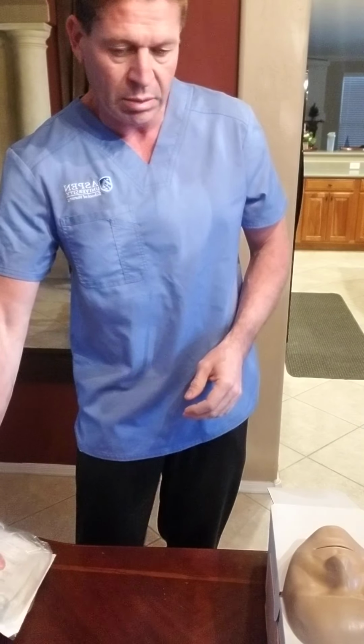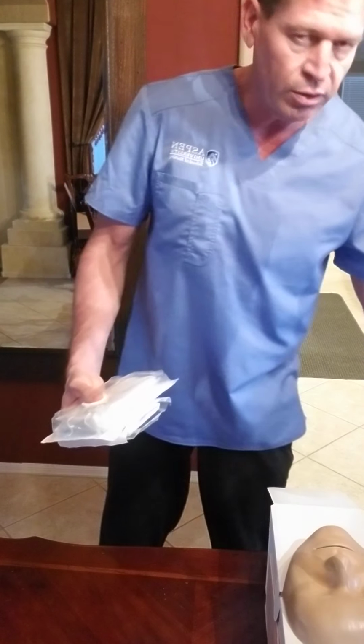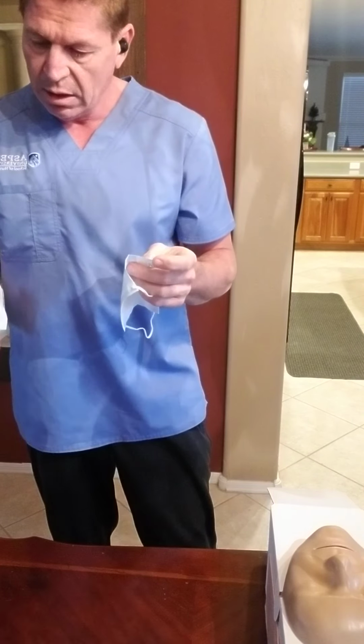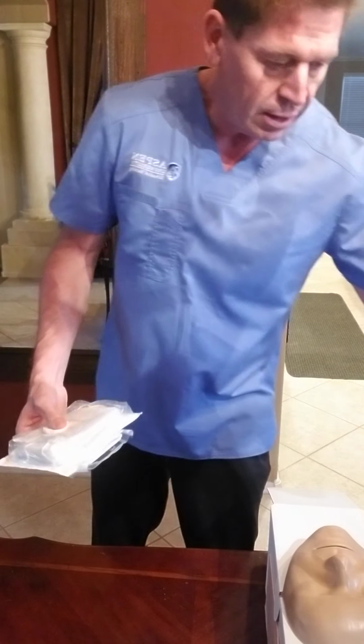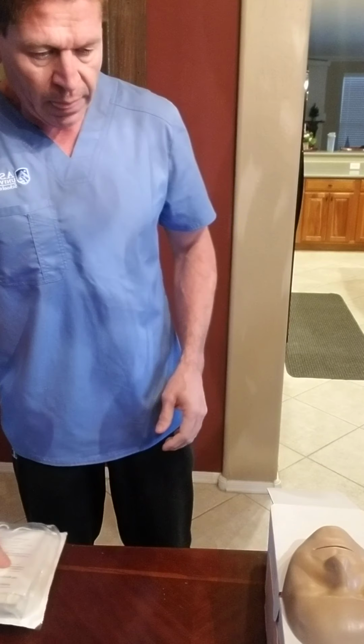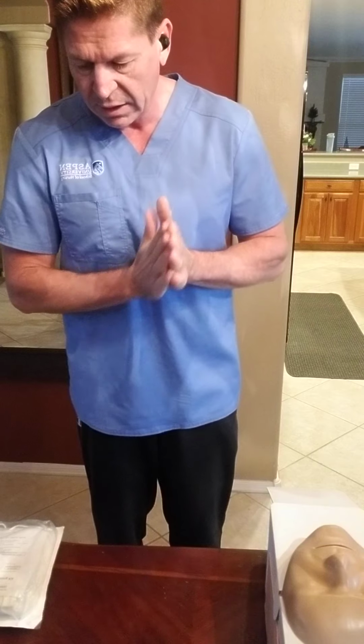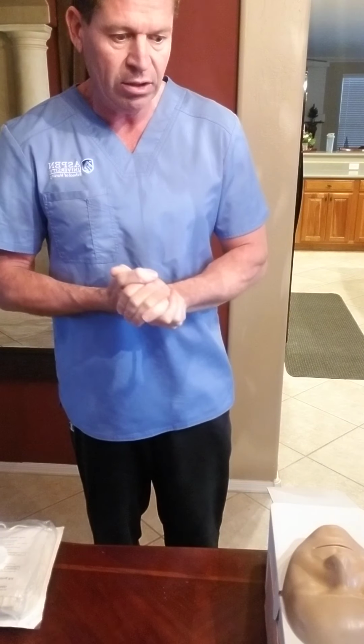So now that I have my supplies, I also have an extra mask for the patient, and there'll be a mask for me as well. And so I'm gonna go to the patient's room. Hello, come in. My name is Eddie. I'll be your nurse today. And the reason why I'm here is because I'll be doing a central line dressing change.